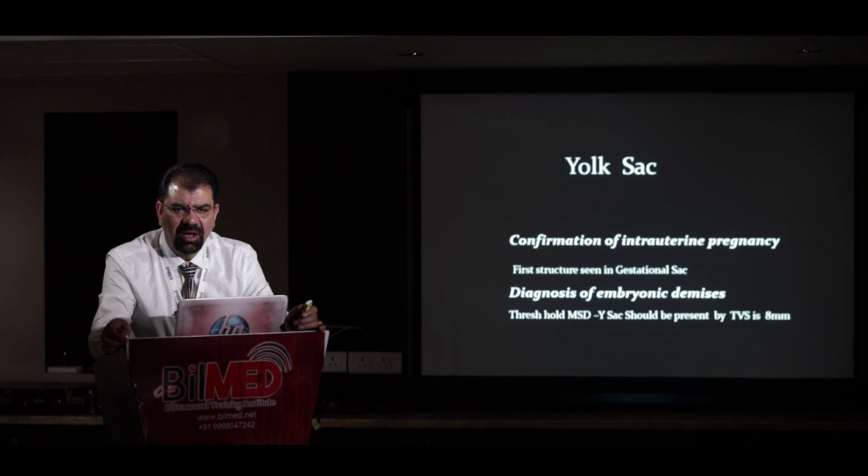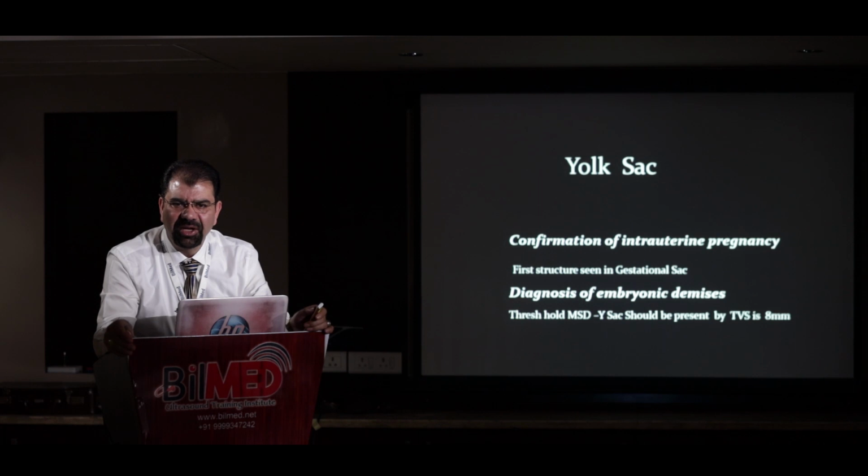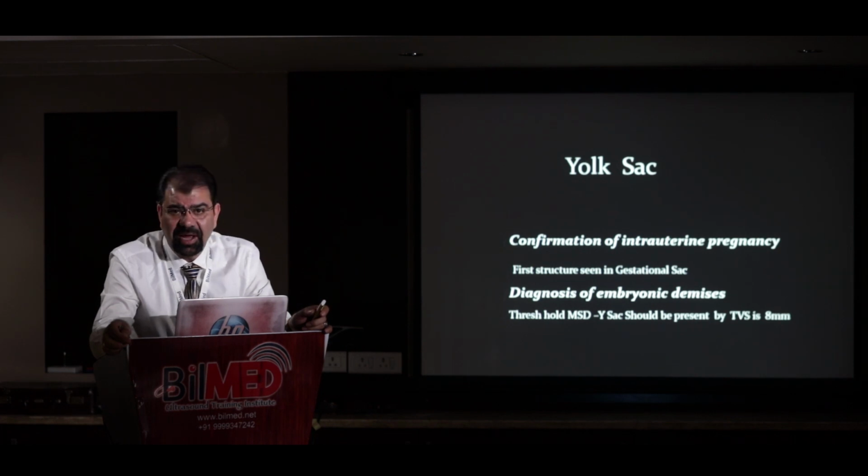Please count how many beats there are, and if it is about 60 to 70, put a hand on the maternal pulsations and it will correspond to 66. The maternal heart is beating at 66, and if the fetal pulsations are 66, then it is sure that you are dealing with transmitted pulsations, not the fetal one. So here, what is knocking at the door? This severely abnormal yolk sac is telling me, oh doctor, you are getting cheated. Then I will see these lines and come to know that yes, it is true. It is a dead fetus I am dealing with.